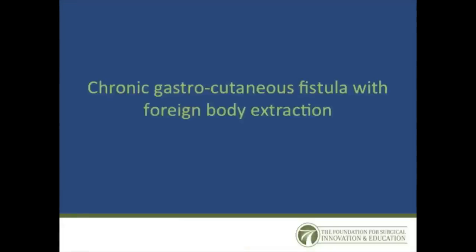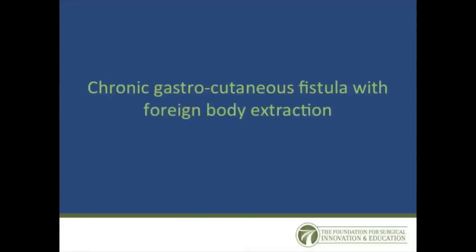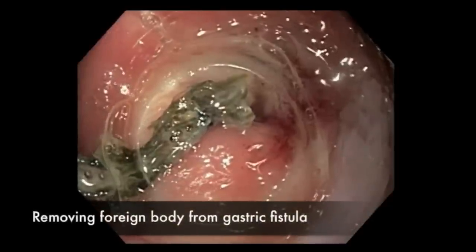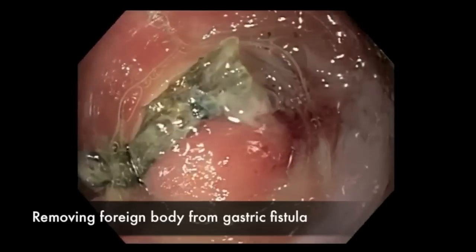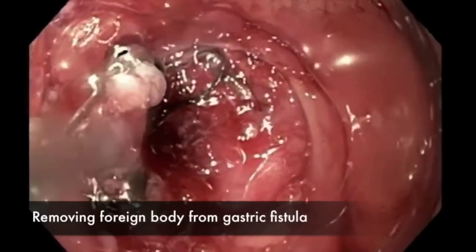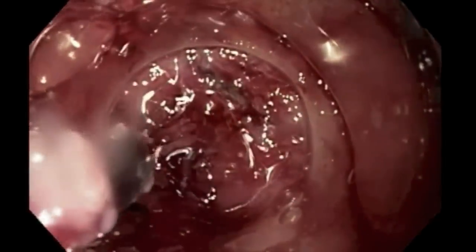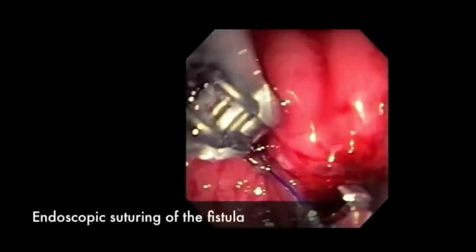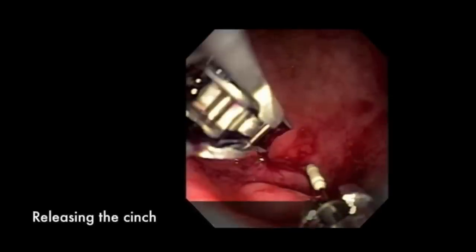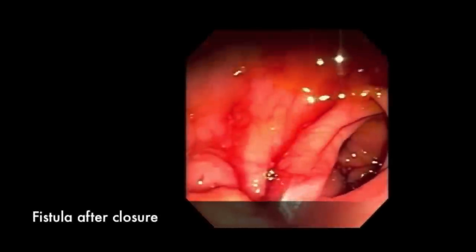A chronic gastrocutaneous fistula closure with foreign body extraction was performed. A permanent suture present from a primary surgical attempted closure was removed endoscopically. The overstitch endoscopic suturing device was used to completely close the orifice of the fistula without stenosis of the pylorus.